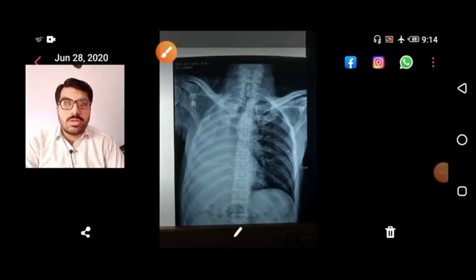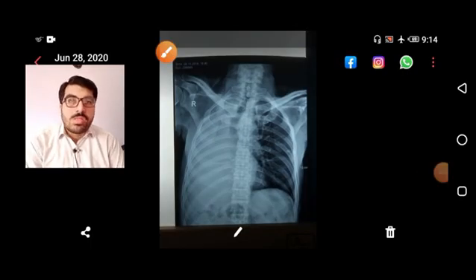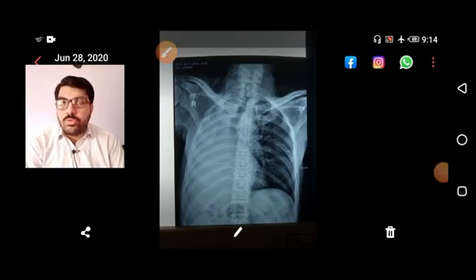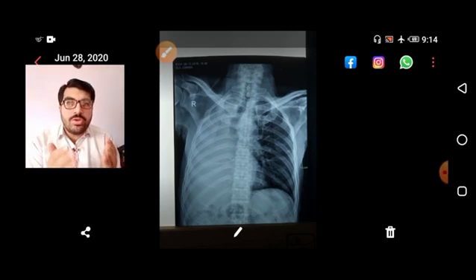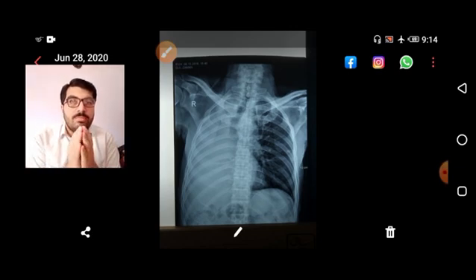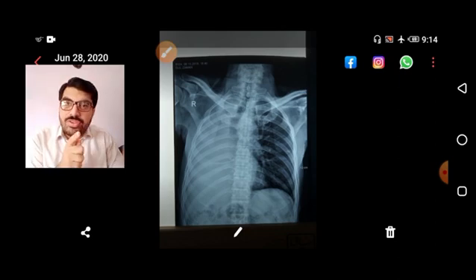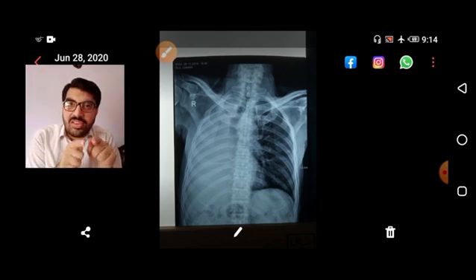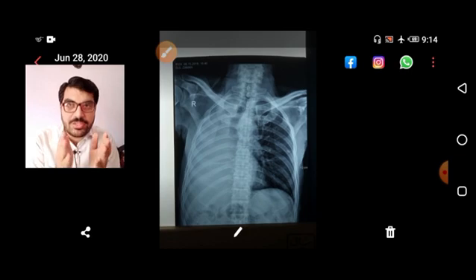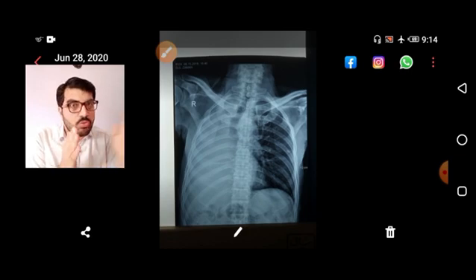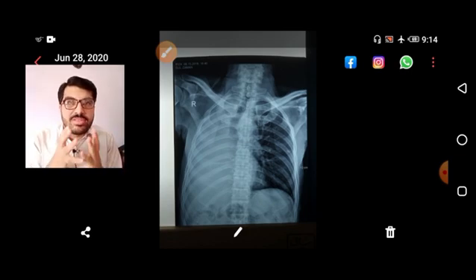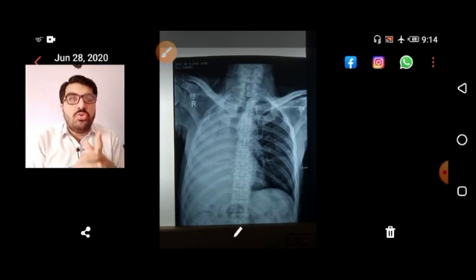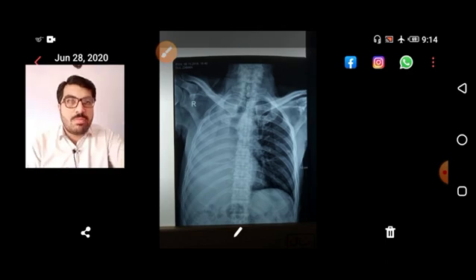Bismillah ar-Rahman ar-Rahim. Welcome to today's video where we will discuss X-rays from real patients in the ward. This lecture is limited to X-rays of real patients, and you will enjoy it inshallah.